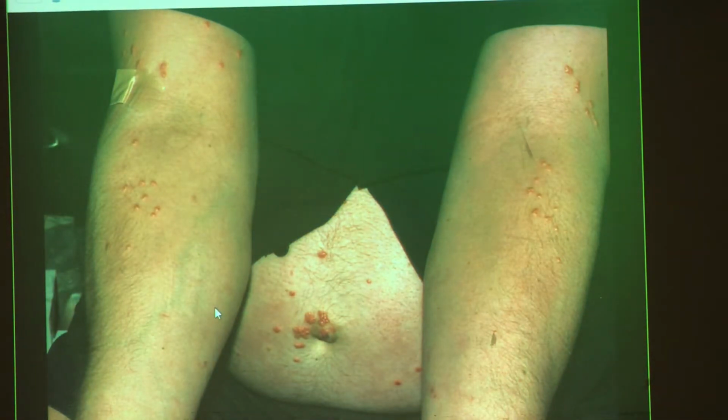Oh, it's arms. I thought they were legs. Sorry, yes. So we have upper arms and exposed belly. Yeah, okay. Well, more nodules. They're kind of erythematous from this angle. Mm-hmm. Yeah, well, yeah. Okay. I think there's another one maybe. Yep. Similar. Kind of looks like pimples. Yeah, kind of. But it's on the wrong parts of the body. Yeah, like they look like comedones. Yeah. Okay. Yep. So here's your slide.